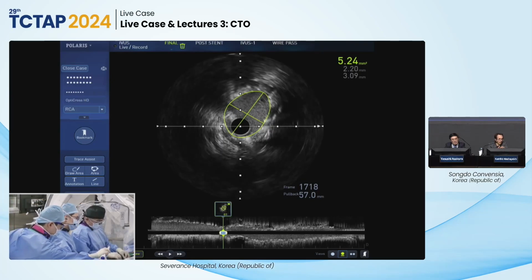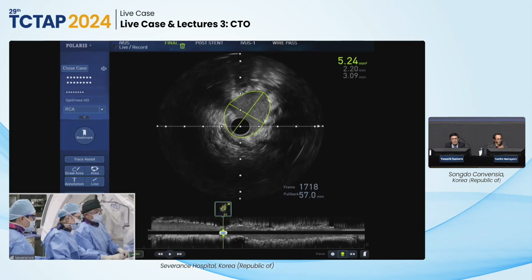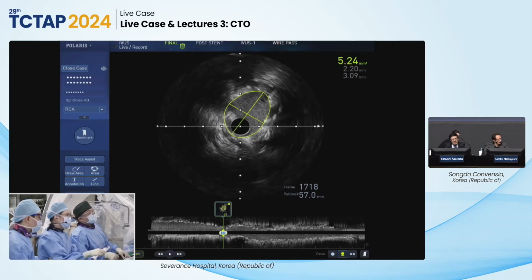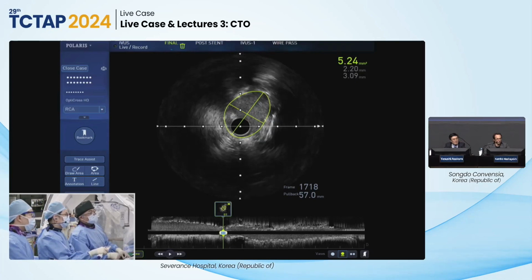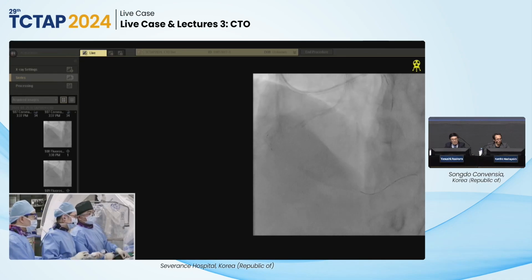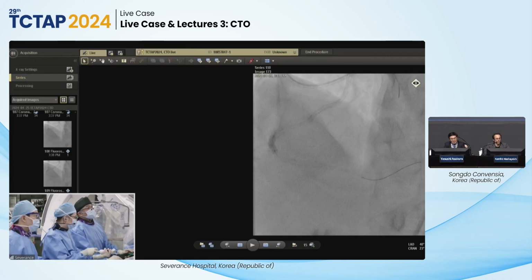And the distal, well, I mean, I took my decision for the distal part, but I think if you ask the audience, it will be 50-50 probably, I don't know, but also the panel, I'm not sure. I think it's quite a big diversity to treat or not to treat that distal lesion. And this is a 3.5 or what is it? 3.0. All right. 22.